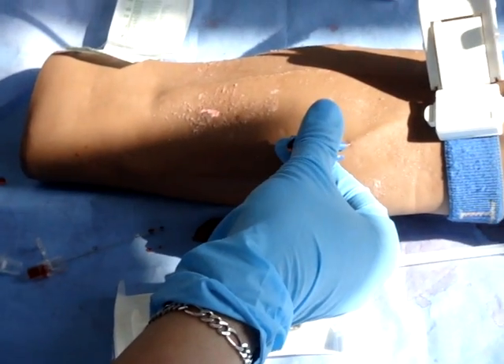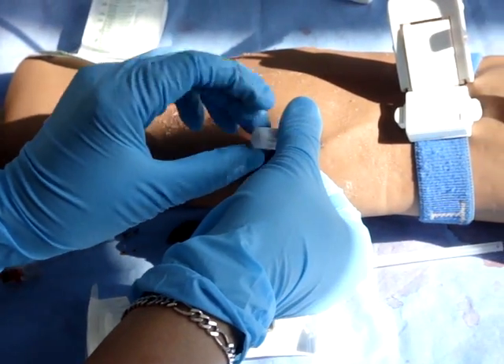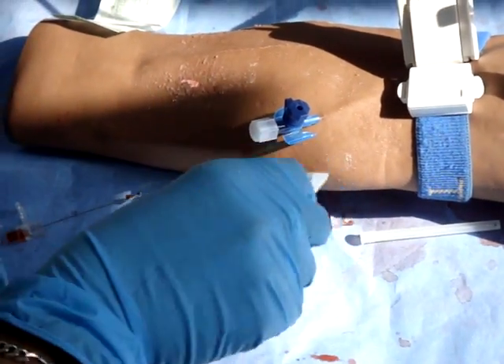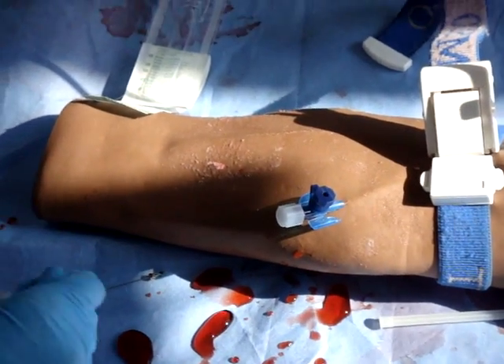Dispose of the end and the sharp, and place the back end onto the cannula. Now we must secure the cannula.